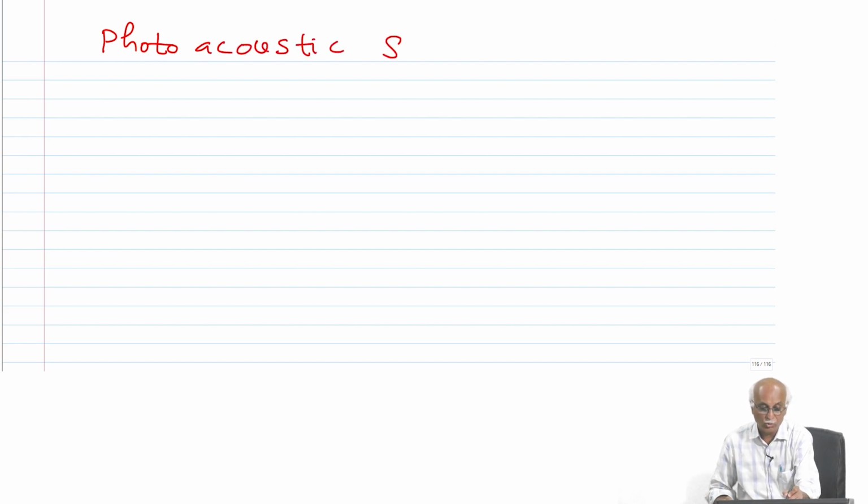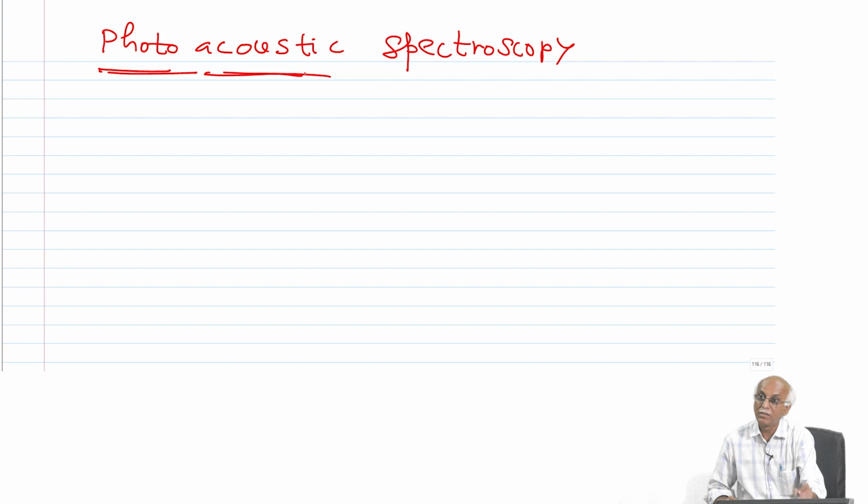For this challenge, a photoacoustic spectroscopy technique can be used. In the case of photoacoustic spectroscopy, as the name suggests, photons interact with the molecules to generate an acoustic signal, and these acoustic signals have very little attenuation when they get transmitted. Scattering is very small when they get transmitted through tissues, etc. So, the losses are reduced.